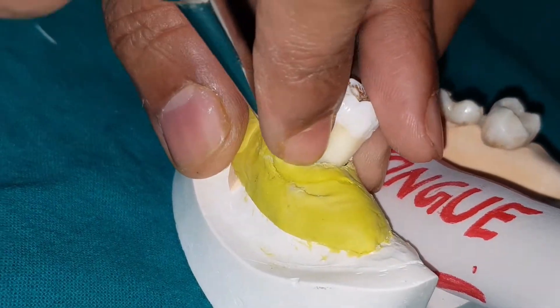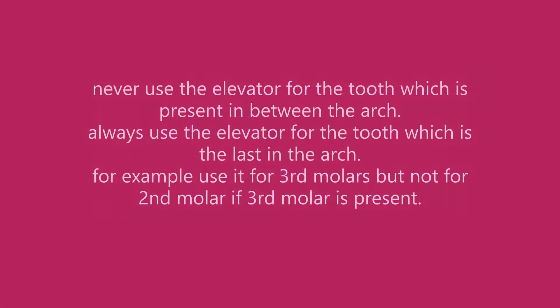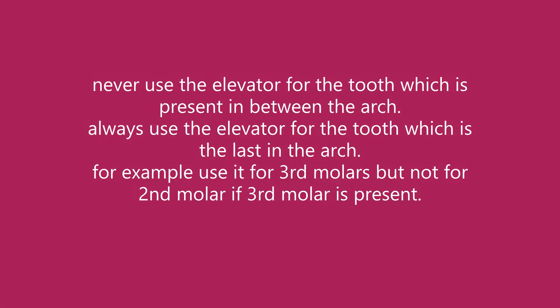The principles of elevation remain the same — lever and fulcrum — and the fulcrum should be the alveolar bone. This is how the tooth gets elevated using parallel placement technique.